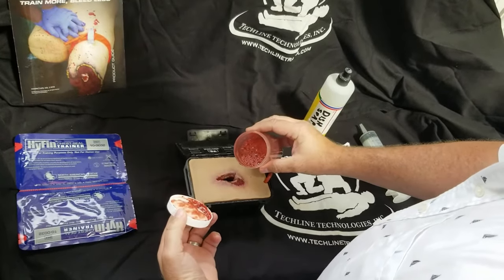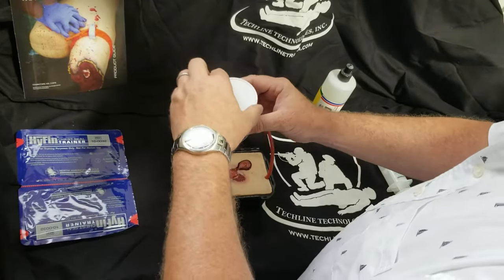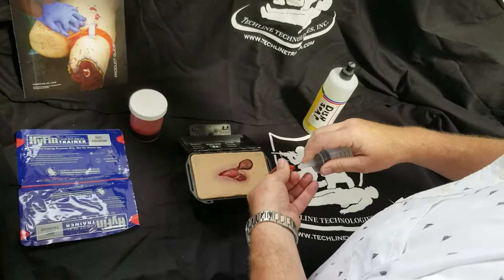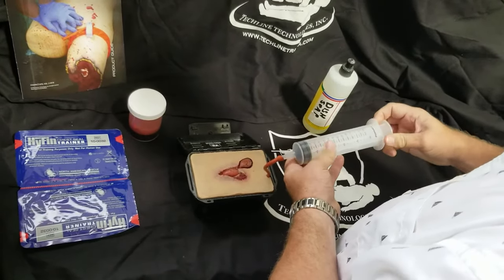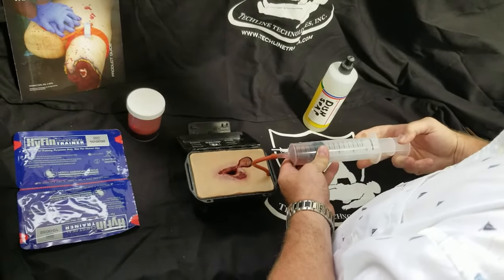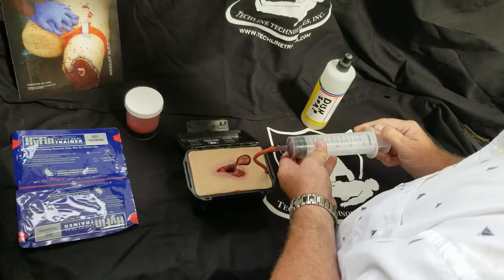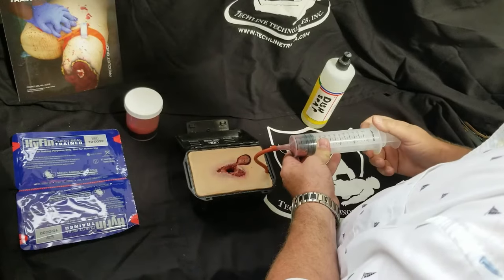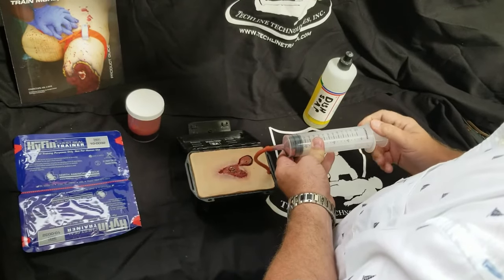Fill the wound channel with the blood simulant, then take a syringe and fit it onto the end of the blood line. You can draw fluid into the syringe, giving it the effect of a sucking chest wound.